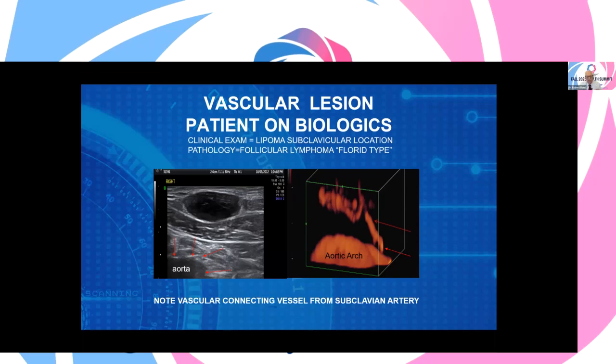This alerted the surgeons. If you go back to the first image, if you look more carefully, there's a lot of information in every picture. We see that the skin is not violated, so it's subcutaneous. We notice that there's a lot of red arrows. This points to the aorta, which we didn't notice until we did the blood flow study. So you can go back and forth learning from each technology as it gives you a lot of information that's reusable. Next, please.